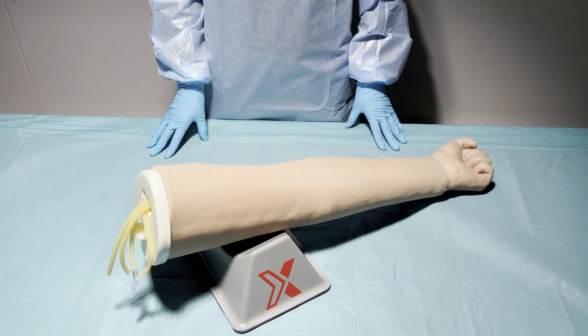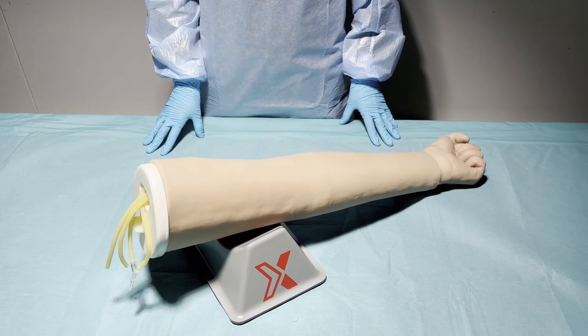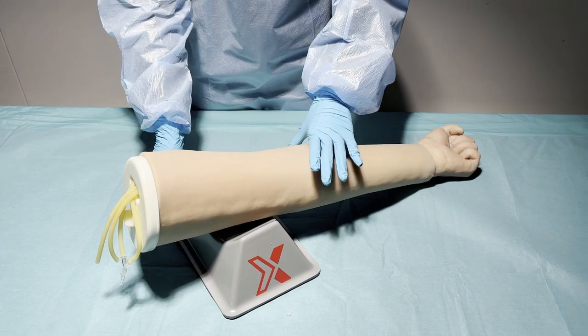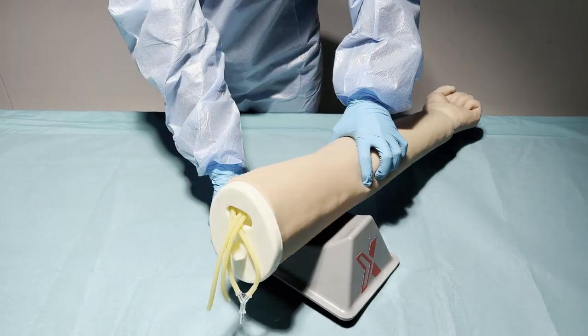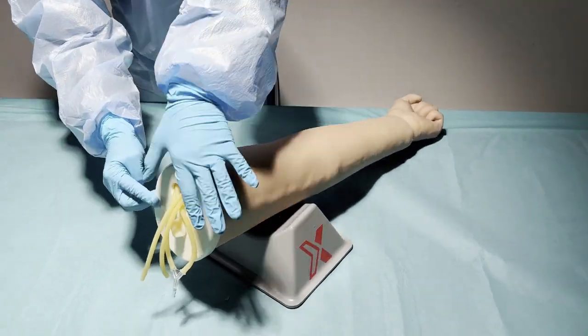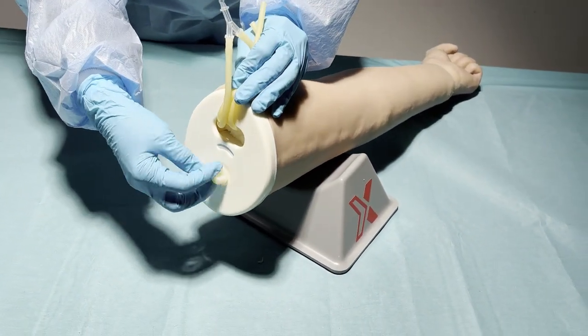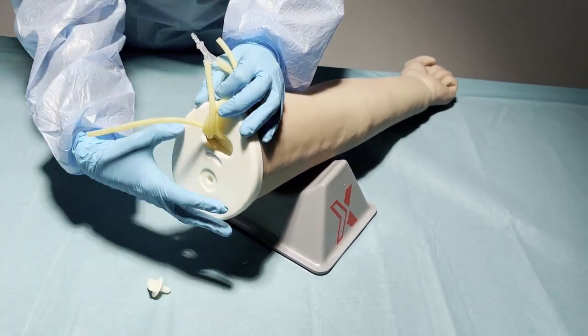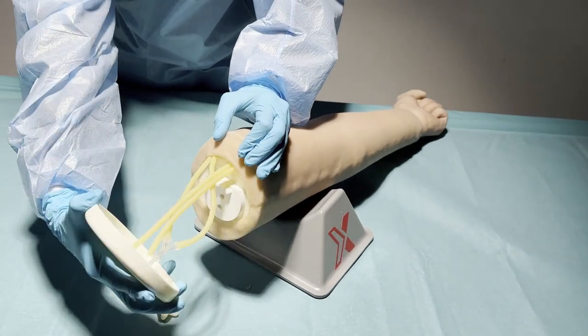Now we are going to show you how to replace the skin and veins of the Medical X IV arm. First we have to remove the white plate at the end of the arm. There is a screw that we can use to unscrew the plate. Put the screw down and then remove the plate gently.